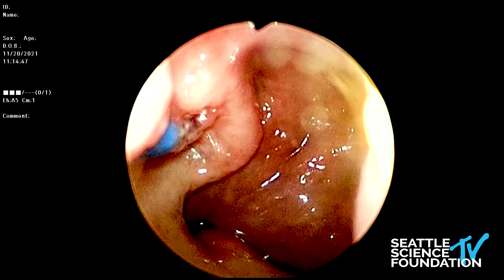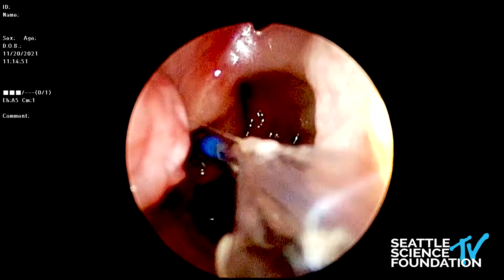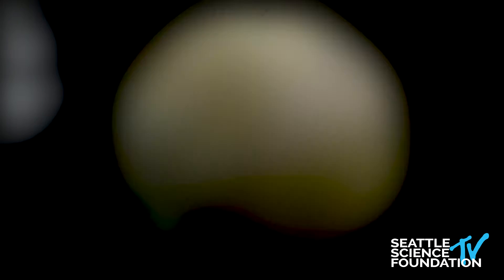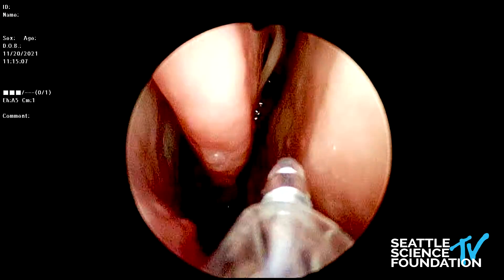This is just finger touch, and I'm not going to dilate it — we're just going to do it like that. So this balloon will be up here. There is no navigation on this balloon because it's pretty easy to know where you're going and where you're not going. The next one — I do prefer image guidance for the sphenoid.